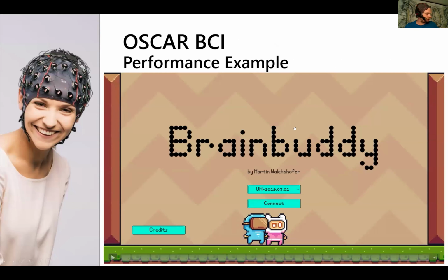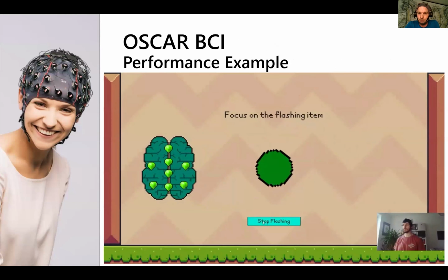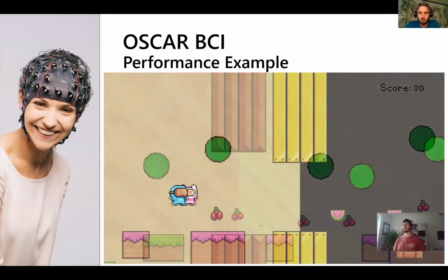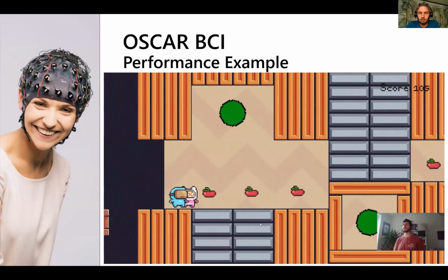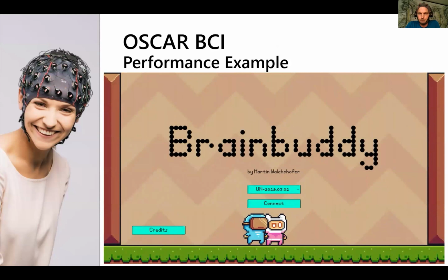I can also show you at least one video where OSCAR BCI is used. It's the brain body game developed by Martin. And here, probably you can hear the sound. It's a jump and run game where you have to focus on flashing items. And when you focus on the right items, then something changes in the scene. So for example, here, the bridges are created and so on and so forth. You can see it takes about 3 to 4 flashes until the BCI recognizes that you are focusing on this item. So that's a very brief and short demo. I think Martin will talk about this a little bit more throughout the spring school.